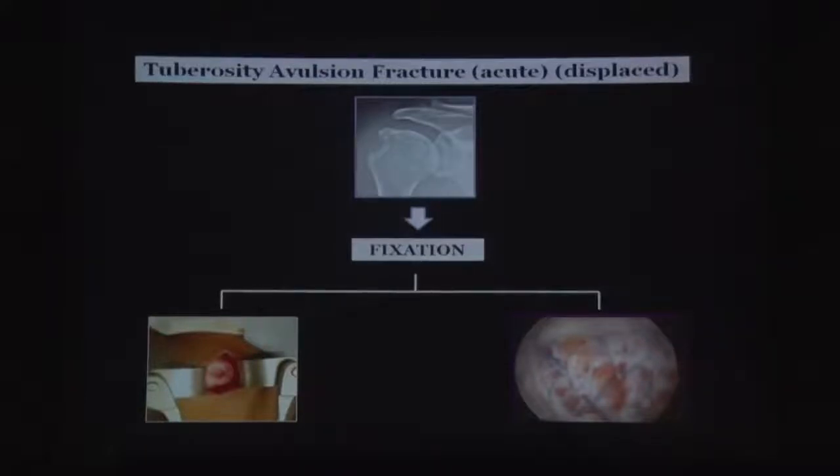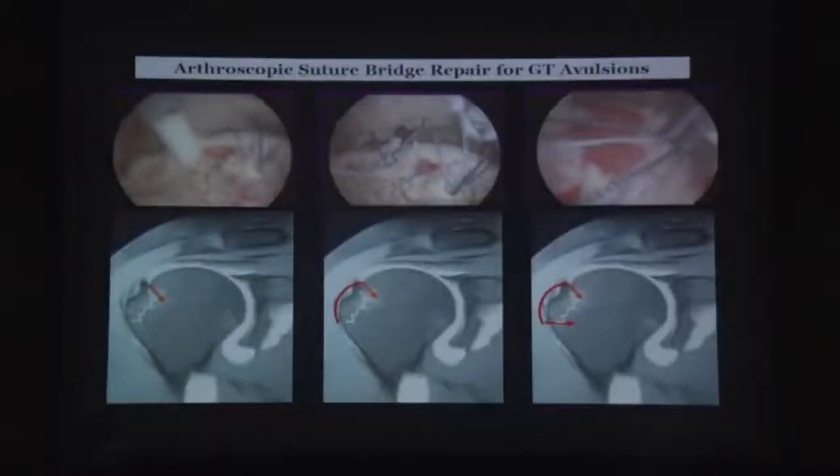Over the years an arthroscopic option has also existed with certain advantages over open surgery. The technique is exactly like a suture bridge or footprint repair: a medial anchor is placed, sutures go through the junction between the bone and the tendon, and then a footprint or lateral row anchor is placed. This means fixation does not go through the bone itself.